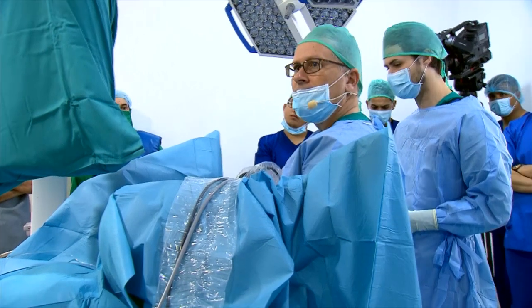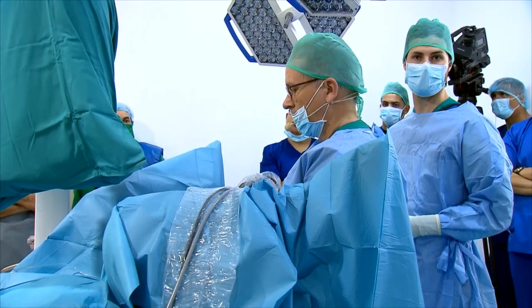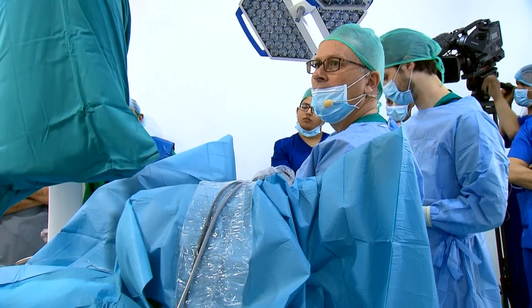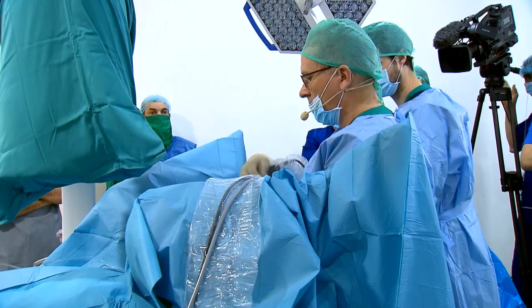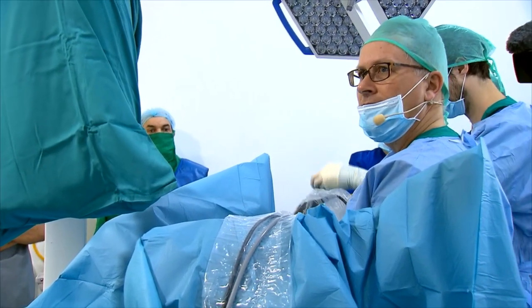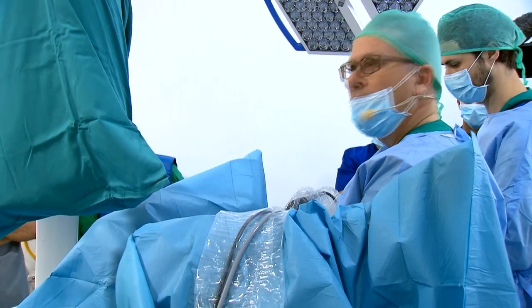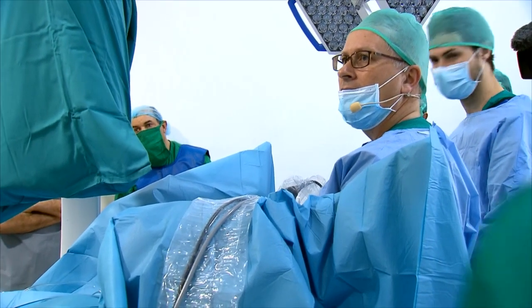Yes, I agree with you during the procedure, but in this first access, personally, I say to the contrary to my resident, when you enter the bladder, why do you have to empty it? You just look for an exploration to see if there is another anomaly in the bladder and see the ureteral meatus and do the procedure without any further thing. You are right, but you are talking about the pathology of the bladder, and I was talking about pushing forward the catheter. This is different. No, I'm not talking about pathology of the bladder. I'm talking about this procedure. In the first entry, there is no need to empty the bladder.